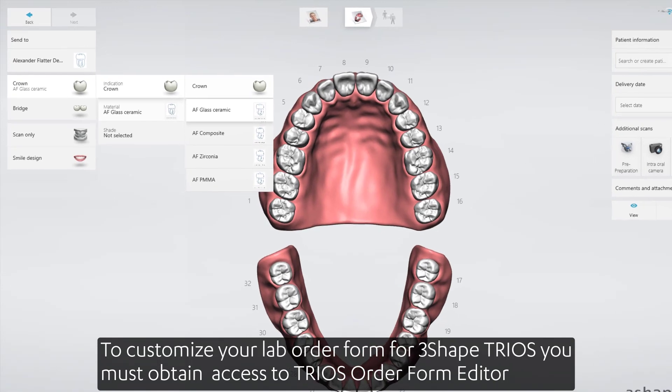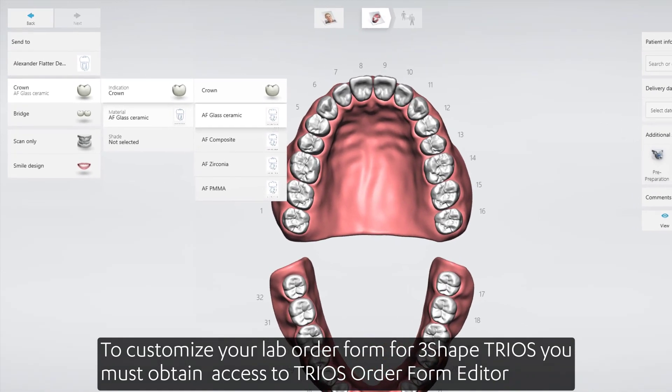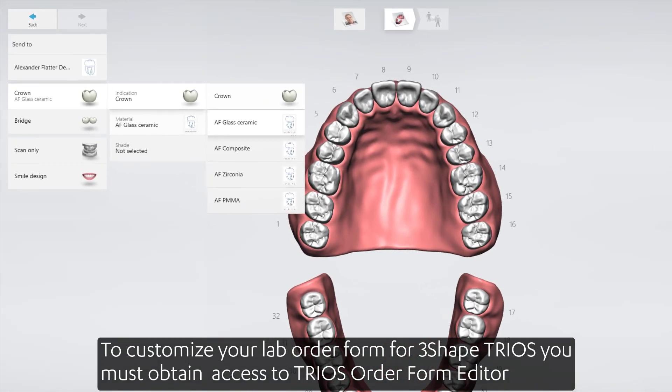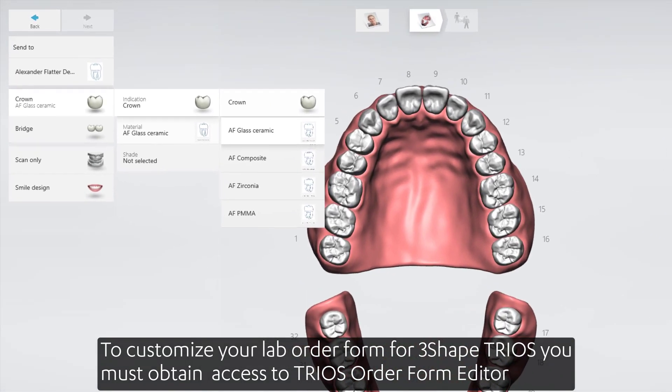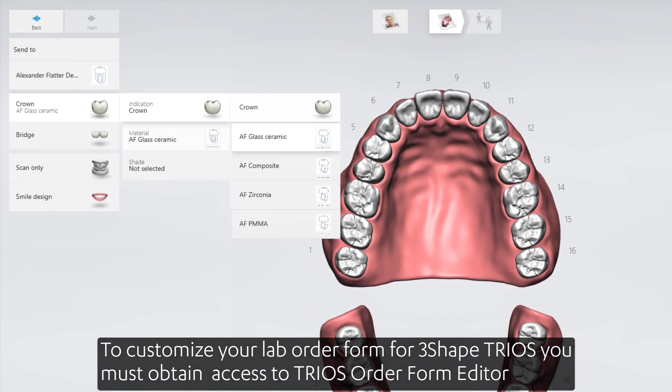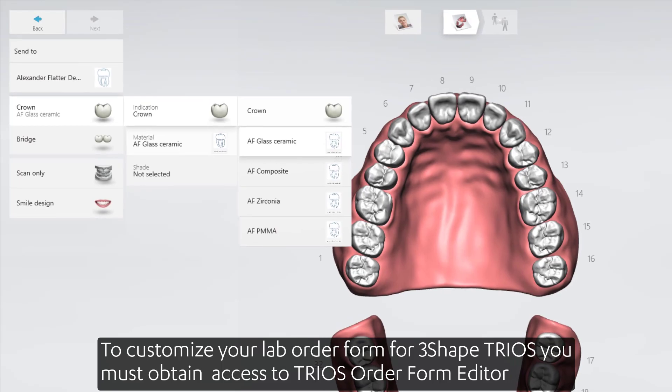To customize your lab order form for 3Shape TRIOS, you must obtain access to TRIOS Order Form Editor.